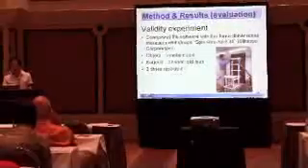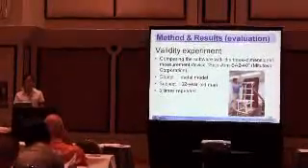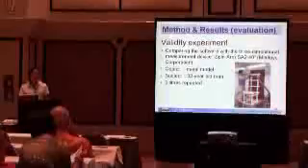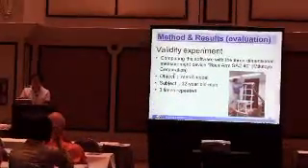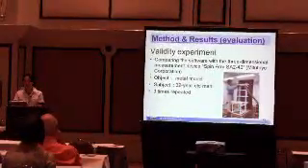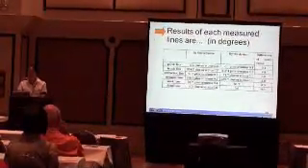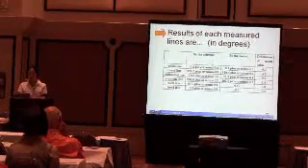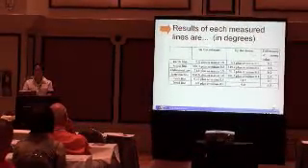And last, we did validity experiments. We compared the software with a 3-dimensional measurement device. I'm sorry. The object is the mannequin model, and the subject is a 32 year old man, measured 3 times. Results of each measurement line are here. Here is the result of measuring by software, and here is by the device.